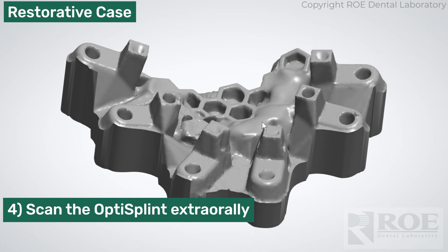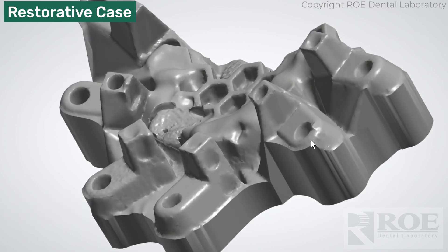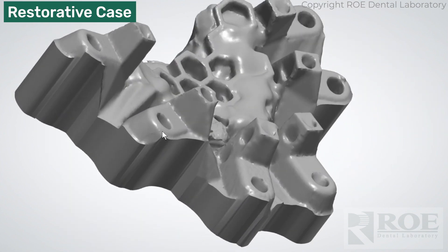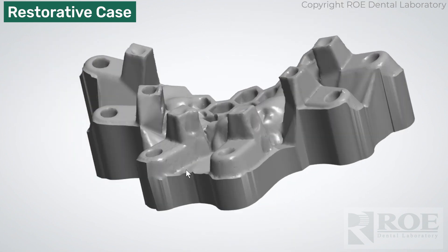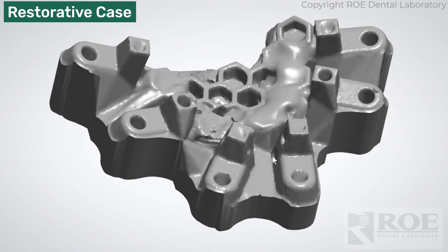It is removed, put on the benchtop, and scanned with the iOS scanner. Nice scan. There are a few areas where this could have been scanned better — try to get the full part of the scan body, because the round part here is the scan body. But we'll be able to make this register. So those are the scans for a restorative case without a wash impression, adding the tissue scan with the multi-units.